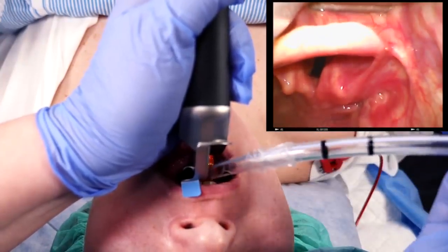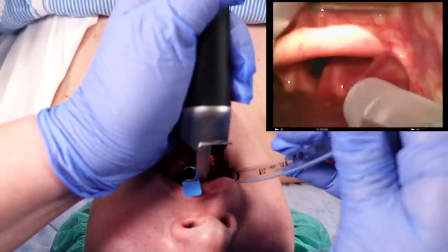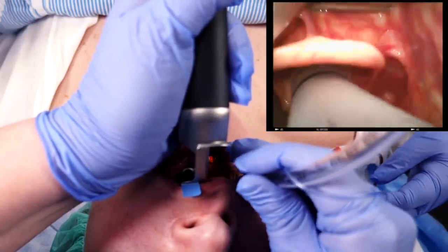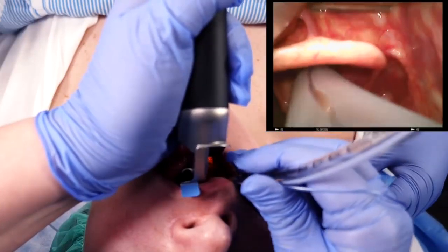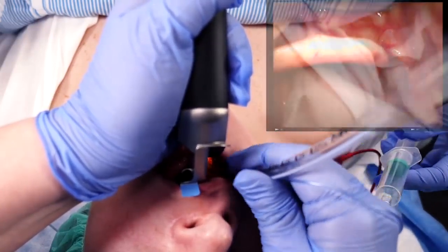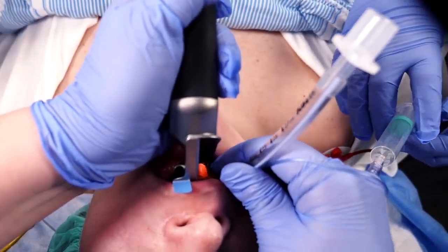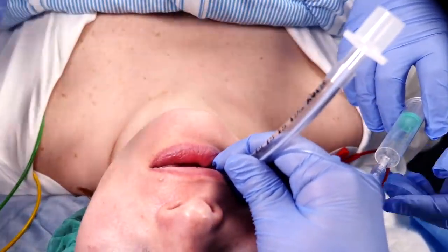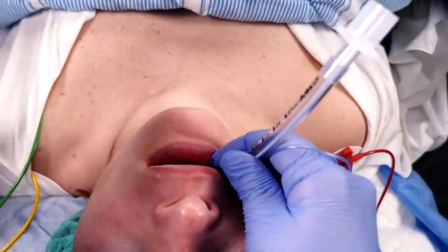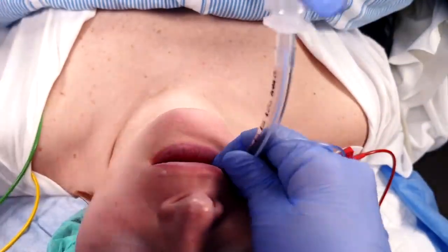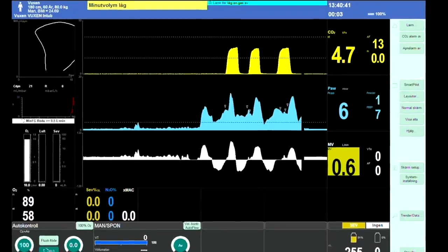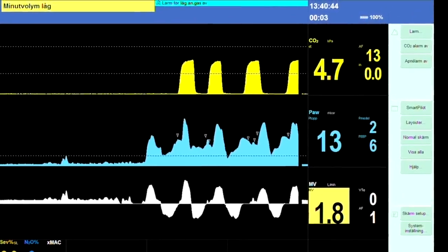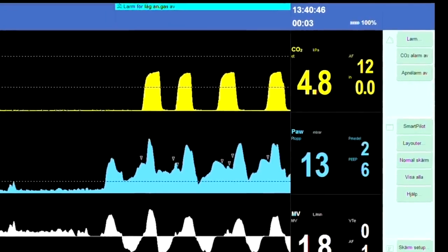Insert the tube carefully. Sometimes a gentle rotation is required to pass the vocal cords. Advance the tip until the cuff has disappeared and the vocal cords are between the two black lines. Ask for inflation of the cuff and carefully retract the laryngoscope. Hold the tube firmly while you confirm that it's lodged in the trachea and not the esophagus. The gold standard is return of end-tidal carbon dioxide over several respiratory cycles.